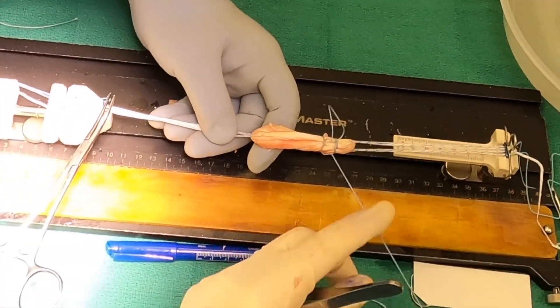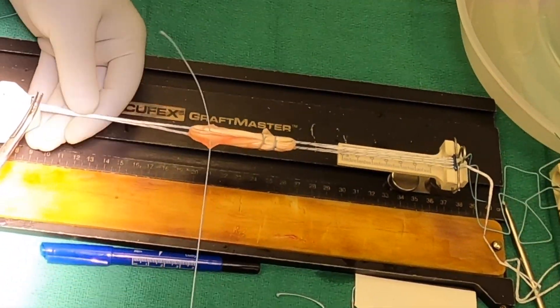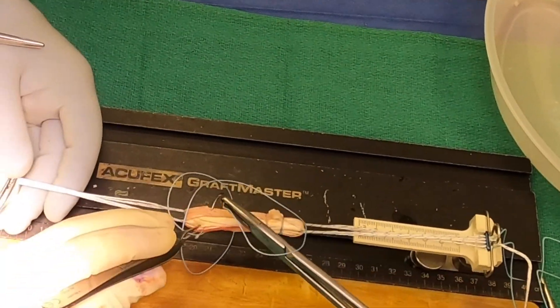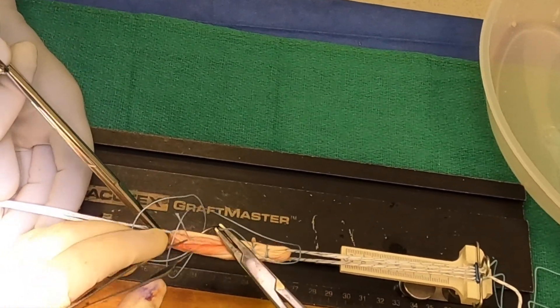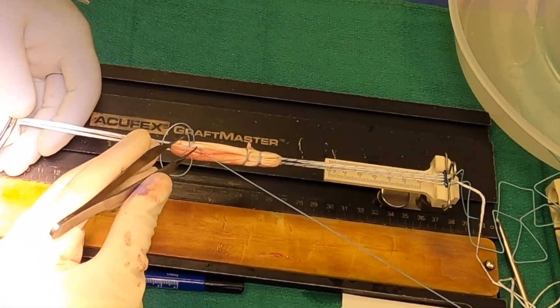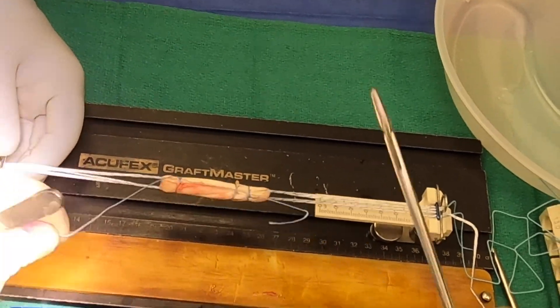The third and final cerclage suture — inside out, over the top twice, outside to inside, finding and retrieving that inside limb, pull it nice and tight, and tie it off.